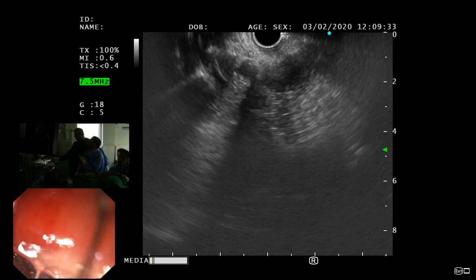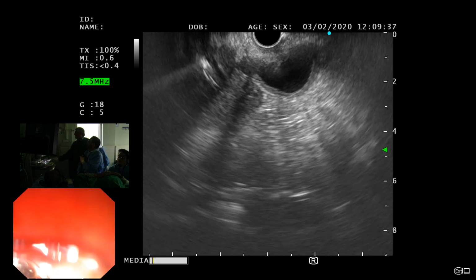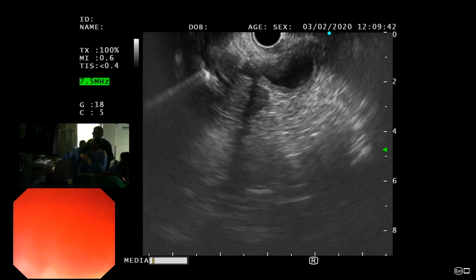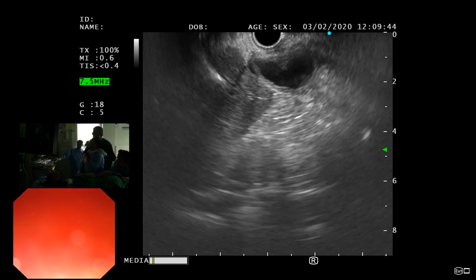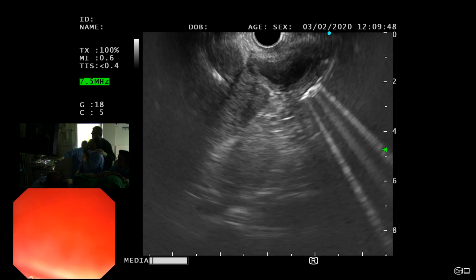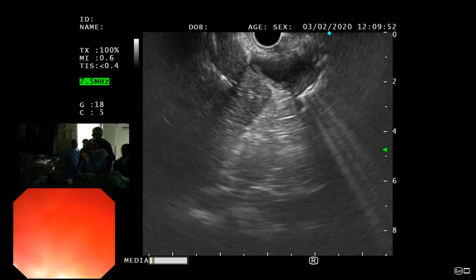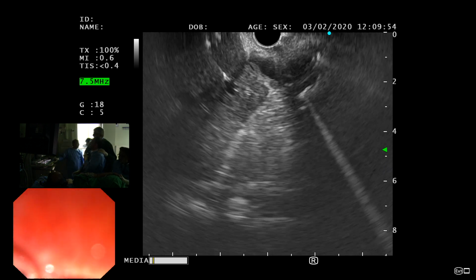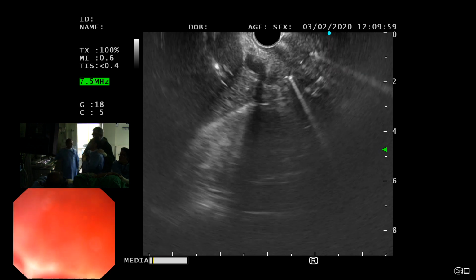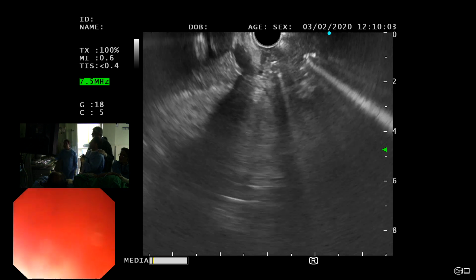यहाँ पे प्रॉबली गॉल ब्लैडर में एक वो है क्या यार, वेट अ मिनट, थोड़ा सा इसको हल्के से मूव कर। Doesn't have any acoustic shadow, so maybe this is a small polyp. Yeah, could be. So movement देखें ना आप, gentle इसी movement में आप अपने tip up करें ज़रा, tip up, pull up. Okay.